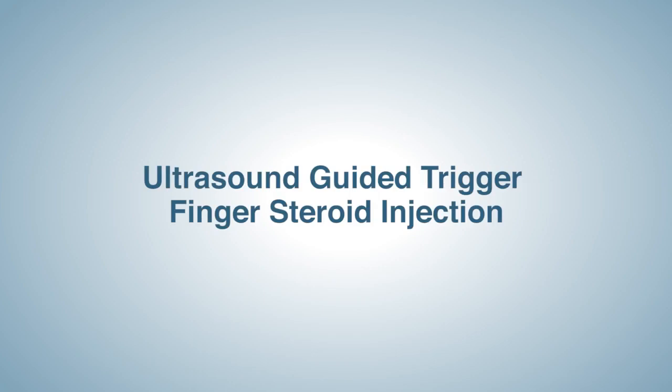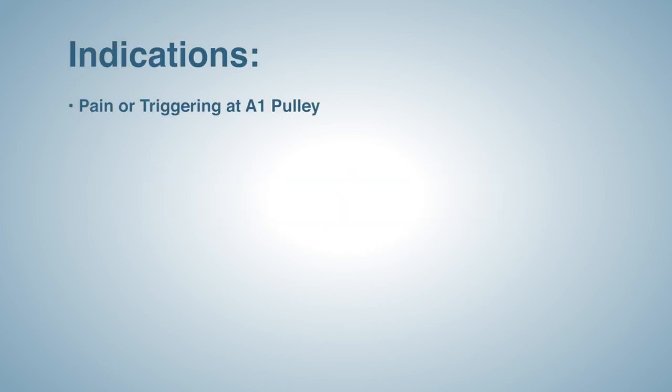The purpose of this video is to demonstrate the technique used for an ultrasound guided trigger finger steroid injection. The indications for a trigger finger steroid injection includes pain or triggering at the A1 pulley.